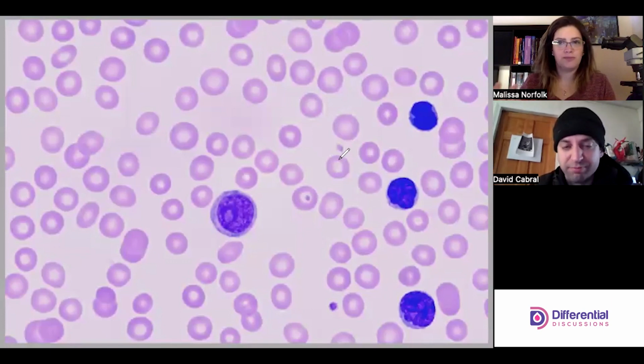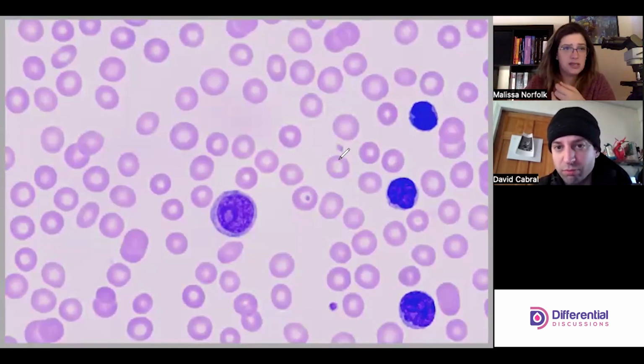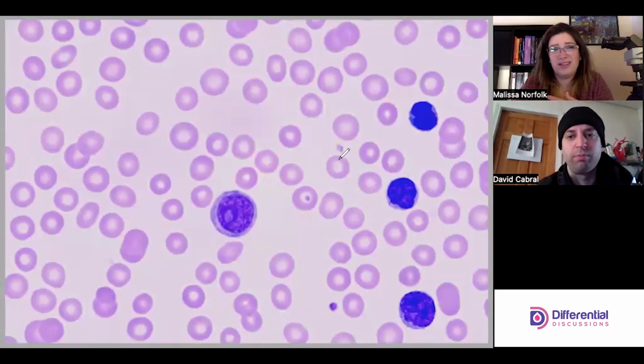All right. So I think the big takeaway from this slide is the pro lymphs. You may see them, you may not see them in CLL, but if you do, they have really prominent nucleoli, and they're a little bit larger than lymphs. And then the lymphs, really CLL is the lymphs. So the small, round, resting lymphs, but they can cleft and make odd shapes when we're looking at a CLL. You want to add anything else to that? I think that about covers it.